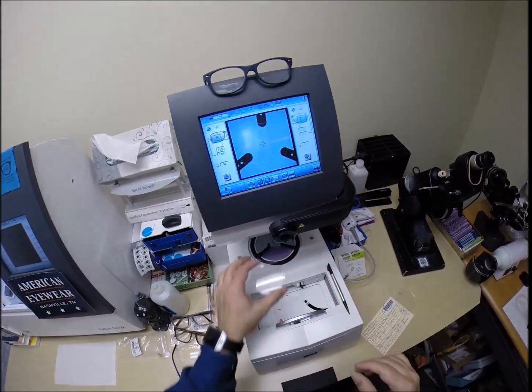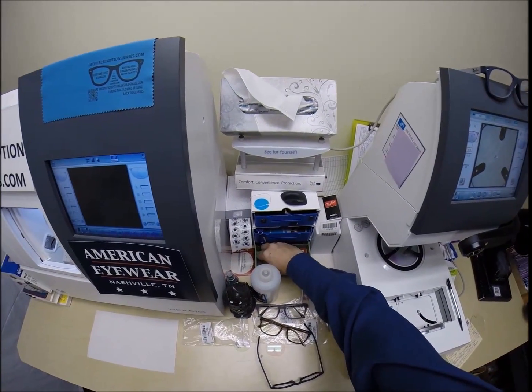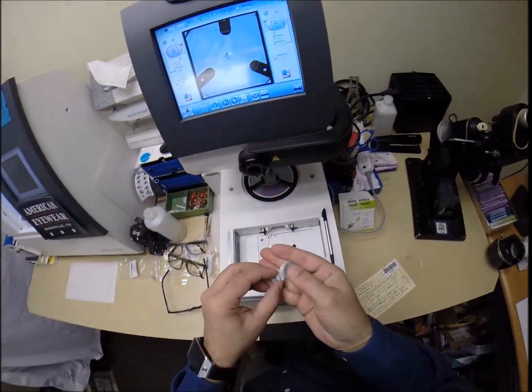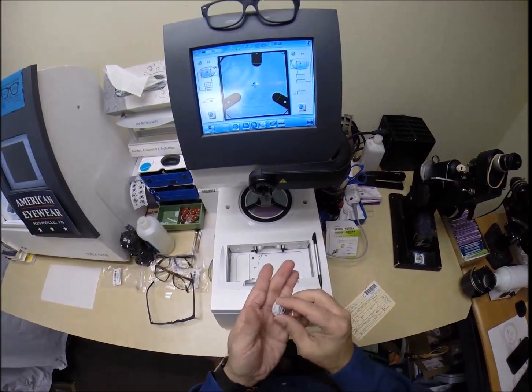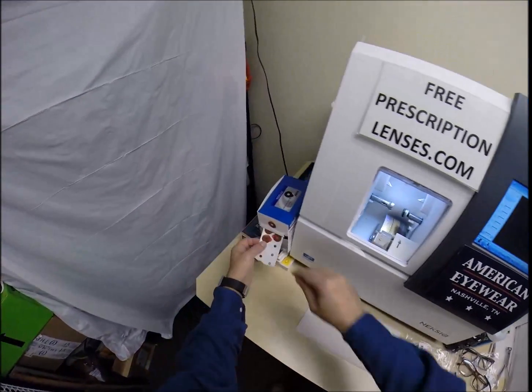So here's the right lens. I'm going to place that onto the platform. Now, this is a block, if I can get them out, that is. This is a block, or as I like to call them, Jenny from the block. I need to attach this to your lens while it is cutting, so I need two double-sided adhesive stickers. Let me grab a couple.